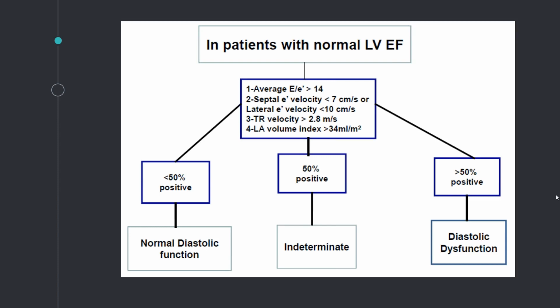And when I look at it in the lab, I find myself putting a lot of indeterminate. And then there's always this question: do you just say indeterminate, or do you blend it with the old guidelines? Because often, what's indeterminate in this guideline would be grade 1 if you use the old one. Have you noticed?